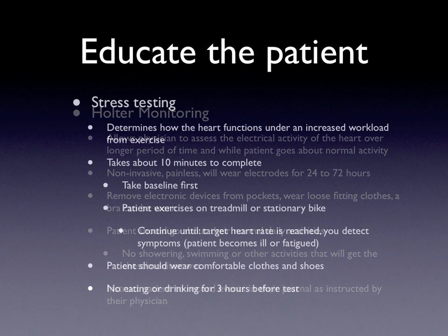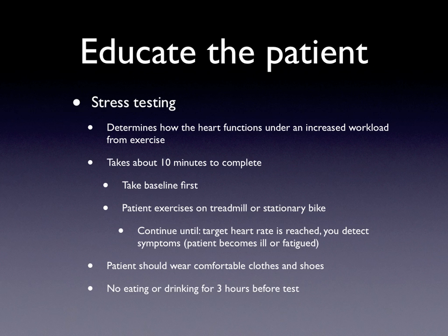Next, we're going to talk about stress testing. Stress testing, again, I've described it to you, and there's going to be a picture here in just a little bit. It determines how the heart functions under an increased workload from some sort of exercise. It usually takes about 10 minutes to complete.